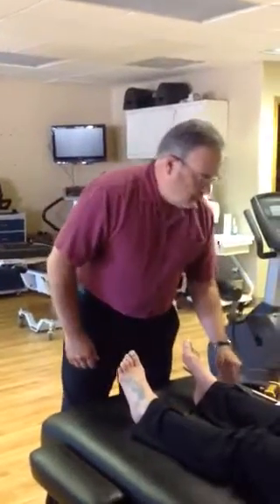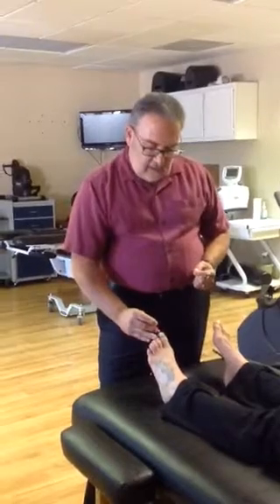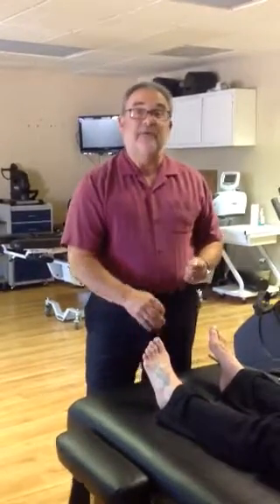Then we test for pain. This is a little pinwheel, or your doctor might use a little pin — a medi-pin. We just do a little poke and see when you can start to feel that pin, to see if the big toe is starting to lose sensation.